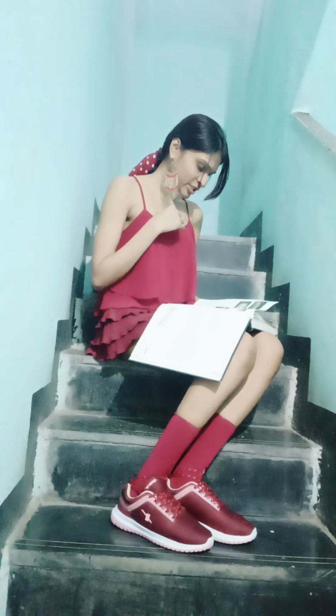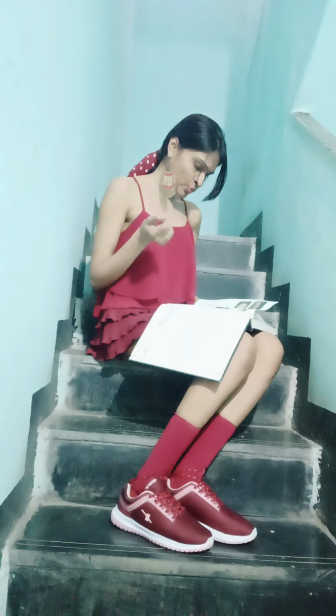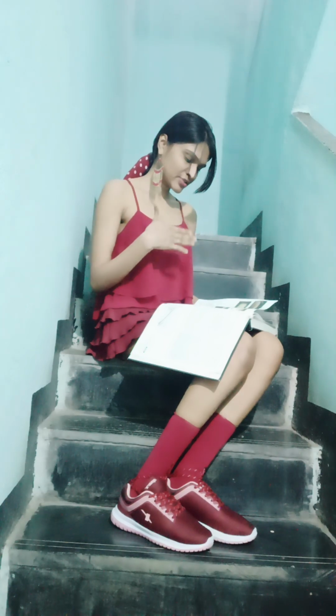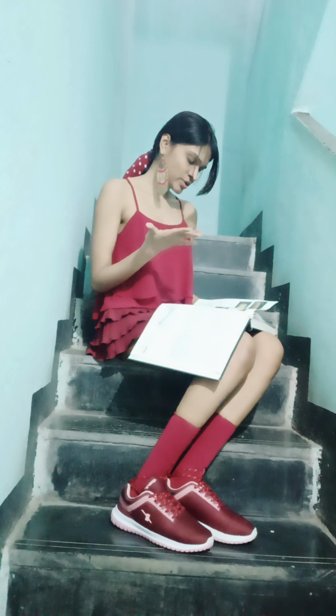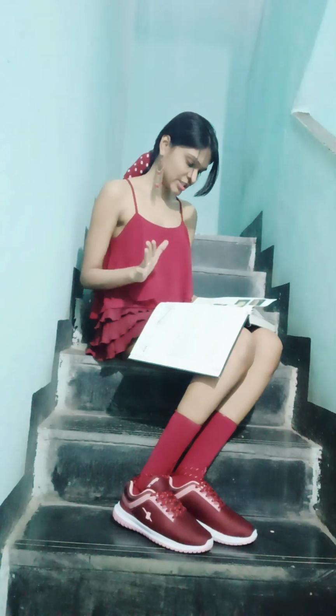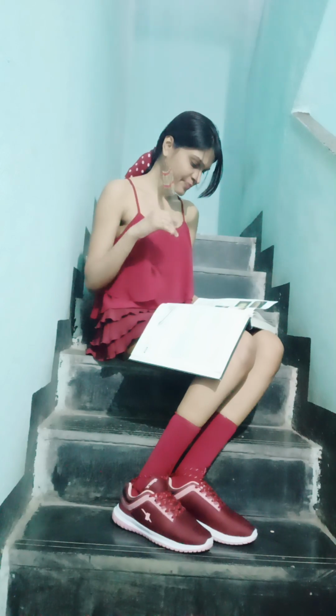Blood vessels are normally not seen in the angle, although loops from the major arterial circle may appear in front of the ciliary body band and less commonly over the scleral spur and trabecular meshwork. They are present on the anterior surface of the ciliary body band, and they rarely extend over or cross the scleral spur and extend onto the trabecular meshwork. Rarely they do. Normal vessels, and these vessels typically take a circumferential route in the angle.